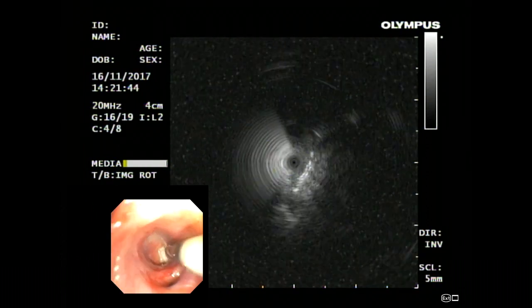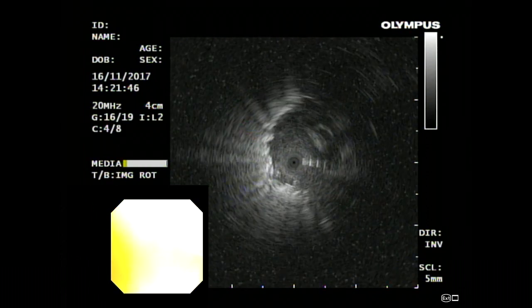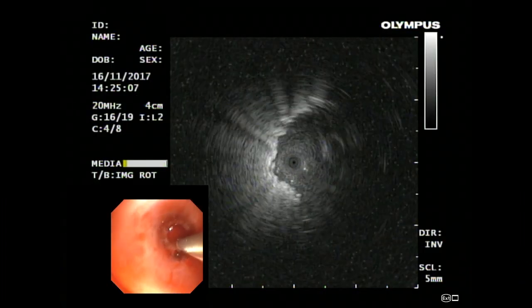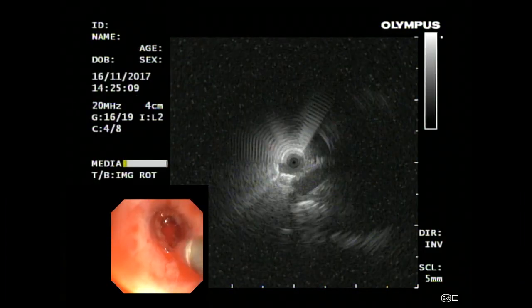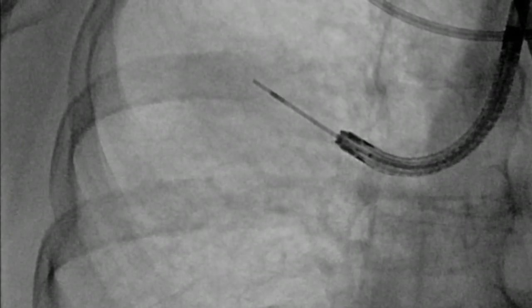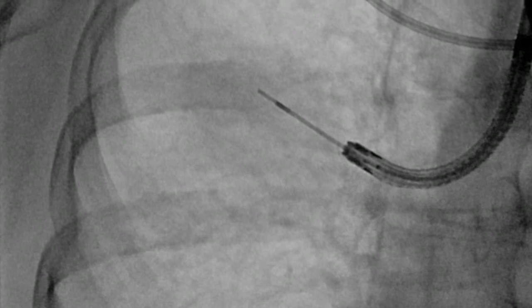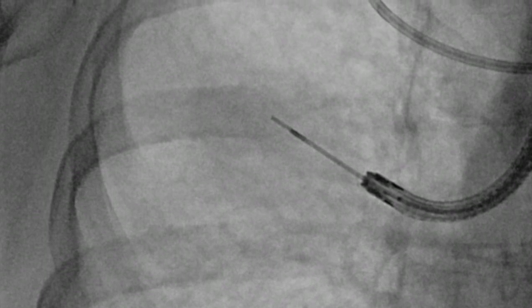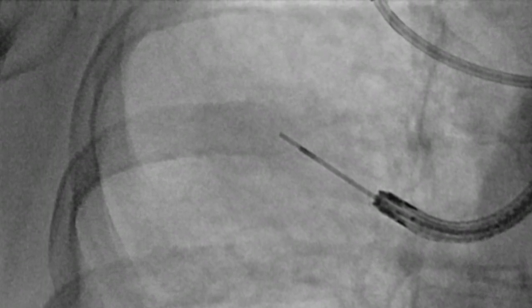Radial probe endobronchial ultrasound is then used to find the best target. As expected, RB2A appears to be the better target, being close to the center of the lesion and away from vascular structures. The position of the probe and its relative location to the lesion and other structures is then confirmed using fluoroscopy, and the image is saved for future reference.